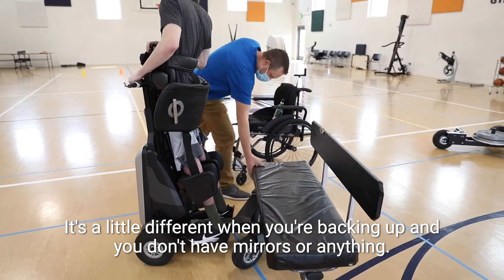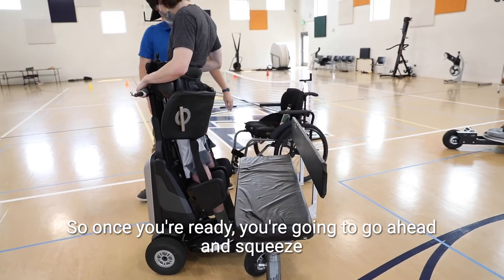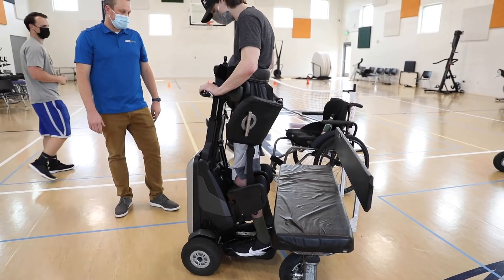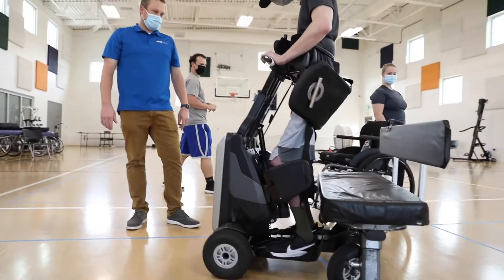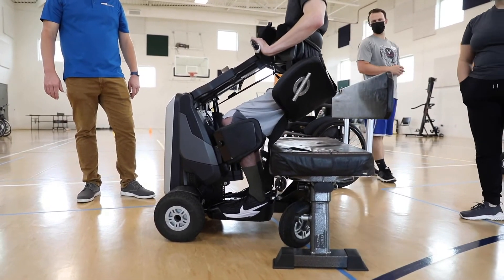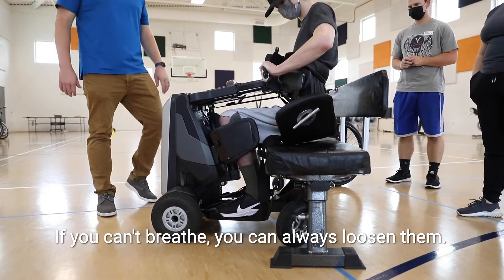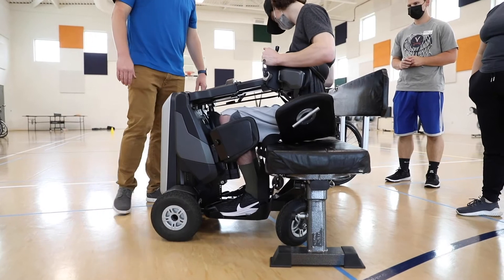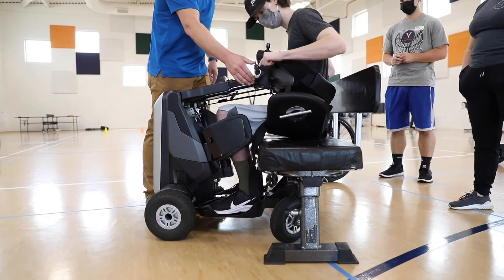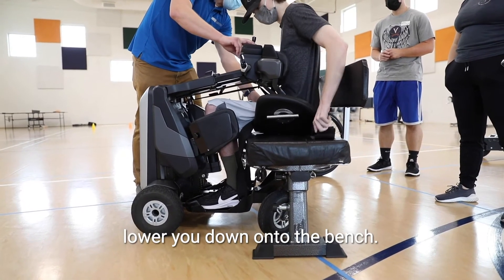It's a little different when you're backing up and you don't have mirrors or anything. So once you're ready, go ahead and squeeze just this side and that'll lower you back down. With those Velcro straps, if you can't breathe you can always loosen them. There's a back support behind you so you don't fall too far back, and then we'll just lower these to get you down onto the bench.